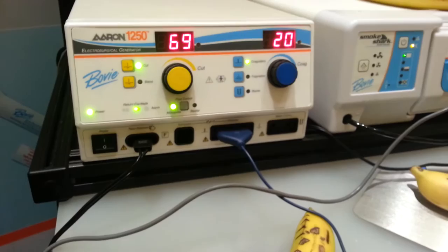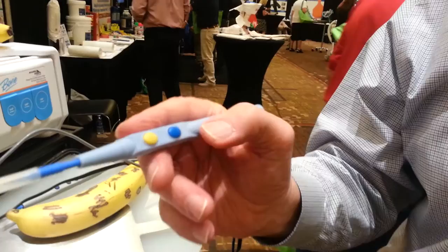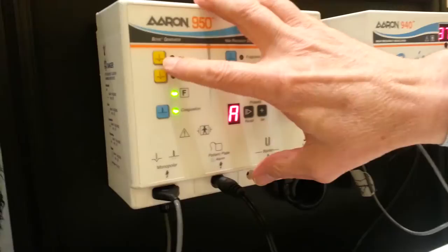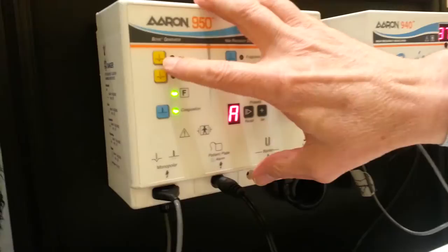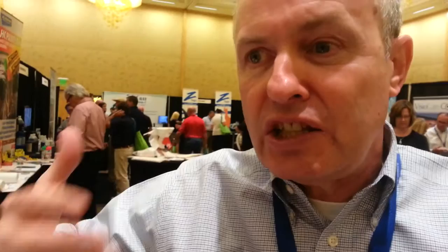The second thing, and probably the most important thing, is that the cut and coag are off the pencil. Where on the 950, I have to go up to the generator itself and hit cut, and then I have to come down to coag to be able to change it.